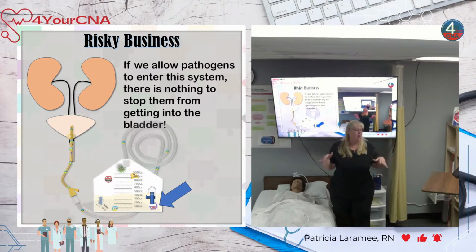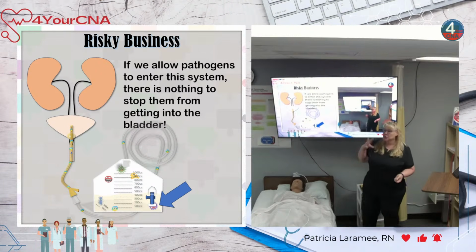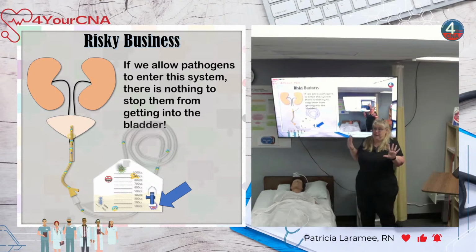Exactly the same. So with males, we have to insert the tube just a little bit further to get to the bladder, but the anatomy, as far as the urethra goes, is exactly the same, just longer. Theirs is external. The additional part of it is external, where we just stick with the internal part. So there's no additional pain, and everybody thinks, oh my gosh, men, it's got to hurt more. Actually, no, because it's the same mechanism.